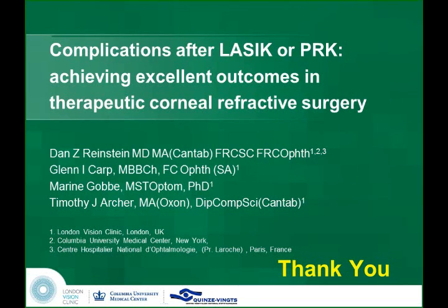But it's the amount of time that you have before the liquid surface tension breaks, because you don't want to start ablating stroma. You just want to ablate the little peaks that are sticking out of the water when the shock wave arrives. You're shooting into the water, basically. It looks like nothing's happening, and then you wipe and you go, whoa! Yeah, it's very surprising. It's like a magic trick.